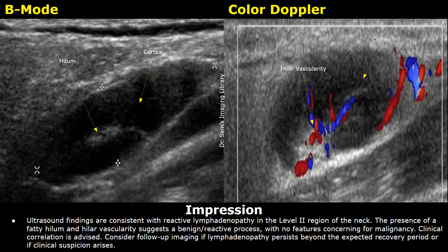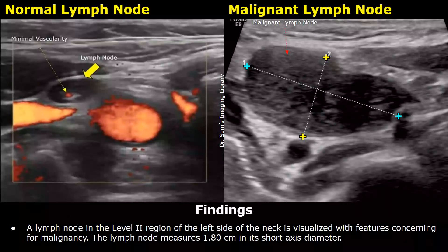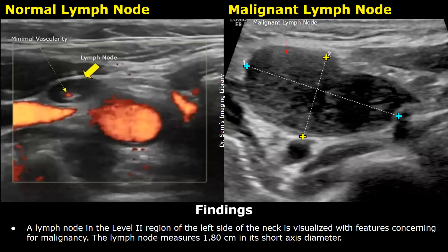Now we have a case of a malignant lymph node. The image on the left is of a normal lymph node, just for comparison. These are the findings: a lymph node in the level 2 region of the left side of the neck is visualized with features concerning for malignancy. The lymph node measures 1.8 centimeters in its short axis diameter.